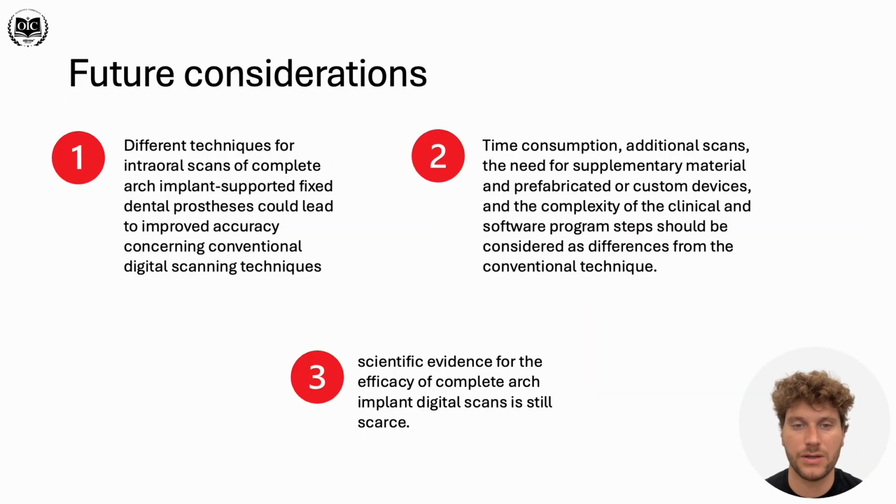Some future considerations and insights from me. As you've noticed, we cannot rely solely on intraoral scanners and standard scan bodies to produce well-fitting passive final restorations every single time on full arch implant cases, but we need to employ some additional workflow measures to improve the accuracy, and then we can get those numbers that we strive for.